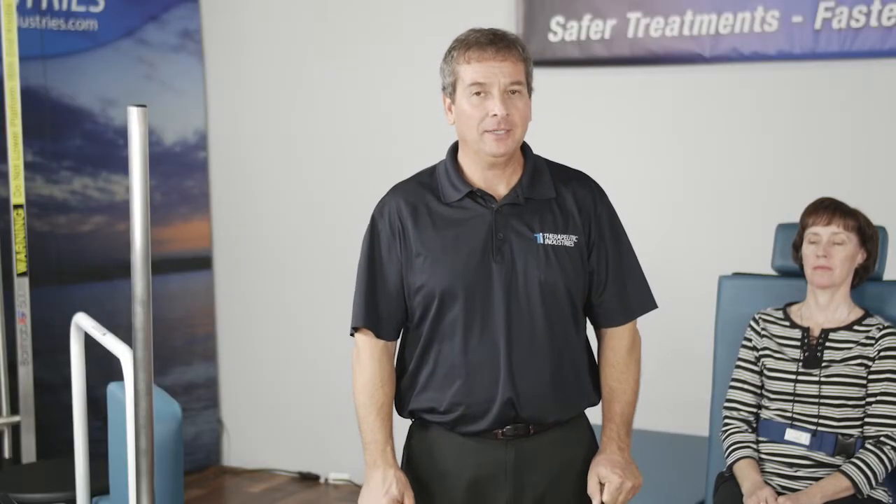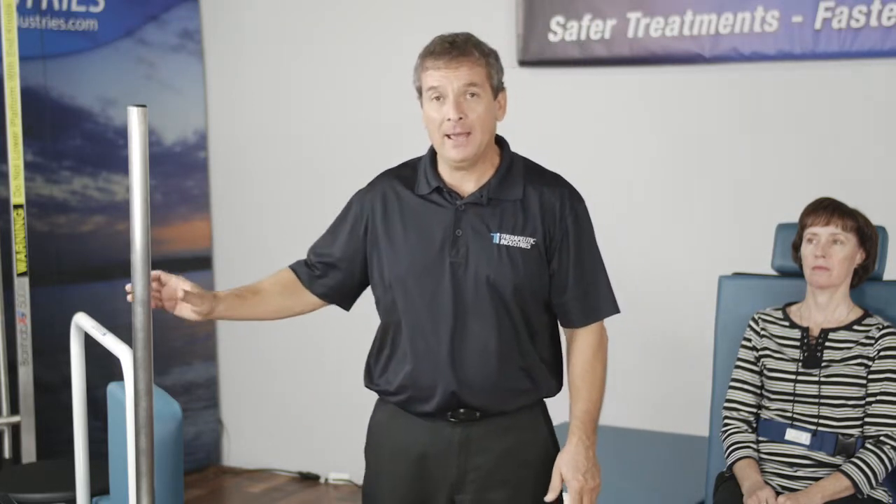Welcome to our standing pole segment. In this segment we're going to show you the different ways to use the standing pole with the Berry Hab.